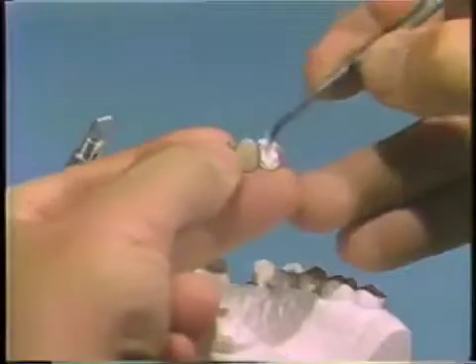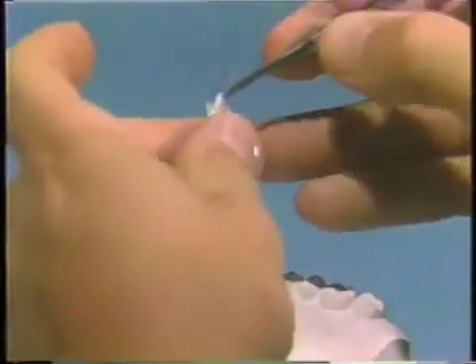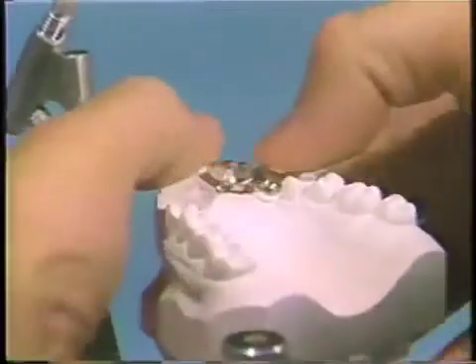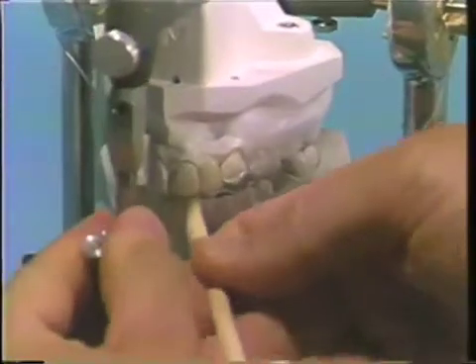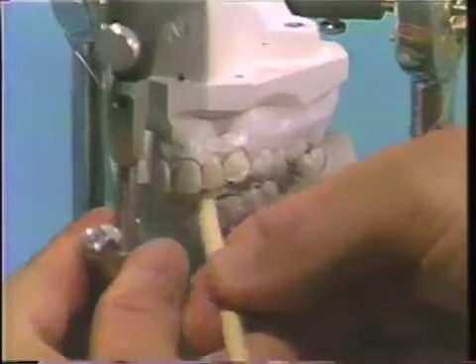In this situation, we will be removing the bridge again to check it in. When enough cement has gone down the pinholes, a small amount will be added to the castings and the bridge will be seated. You must push it down with a fair amount of pressure and then an orange wood stick is used to seat it firmly into place, taking care not to put too much pressure on the pontic area.